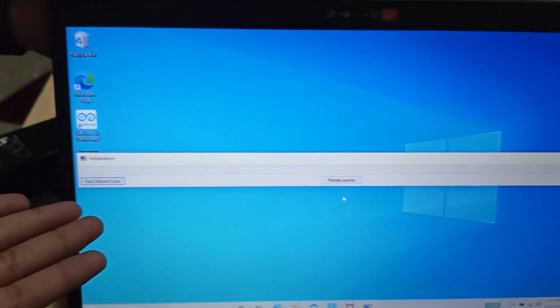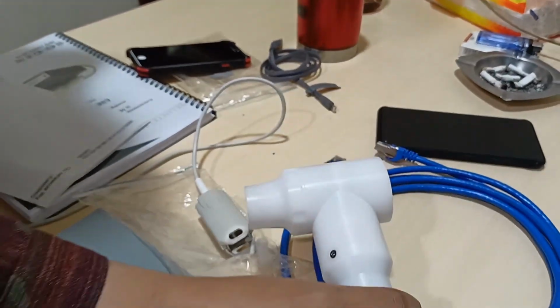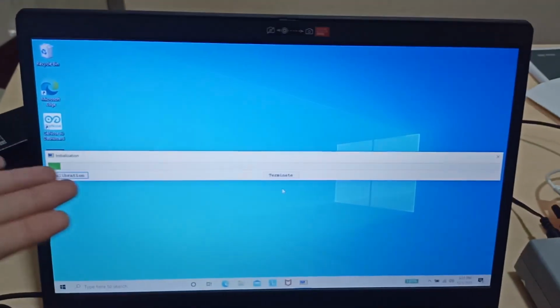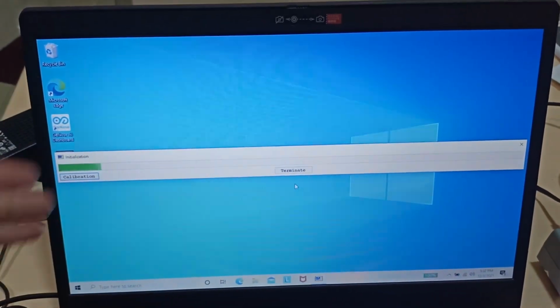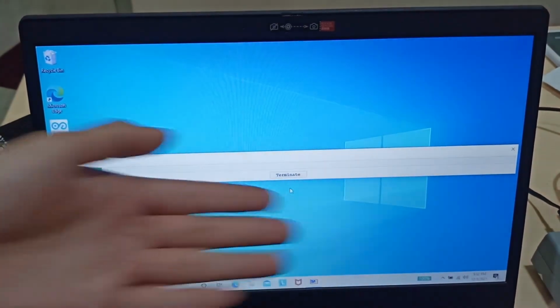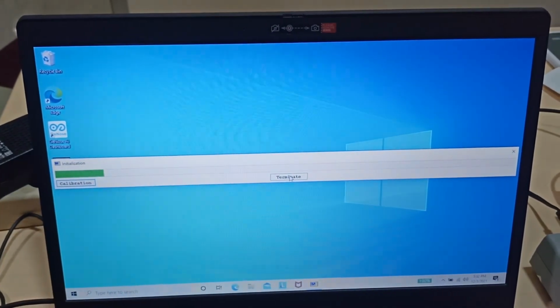Here there is the warm-up of the spirometer itself. For the warm-up, wait first until it is finished. Just a note, if this tool is used for patient examination, then wait until the warm-up is complete. But I skip this for now and click terminate.